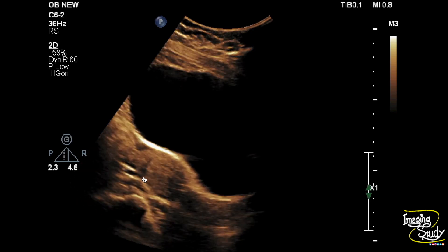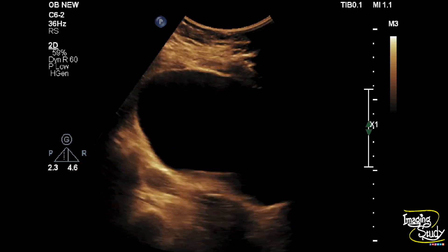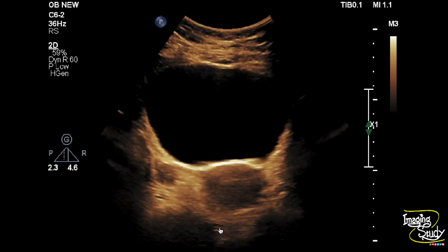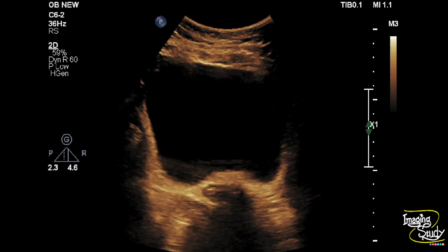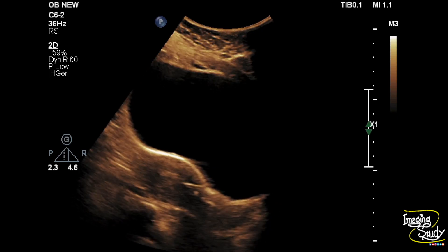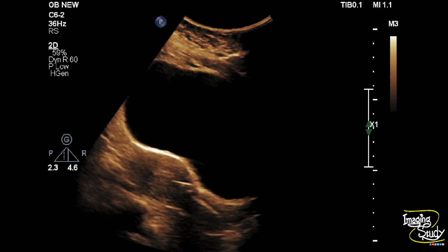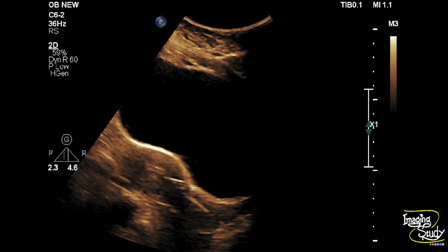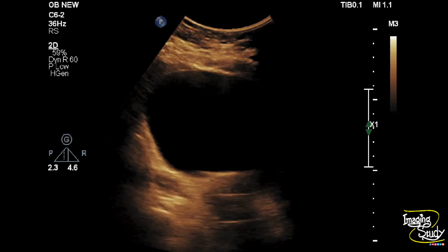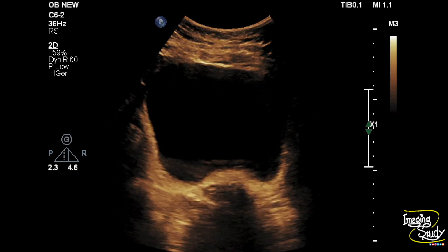The device should be at the upper part of the endometrial cavity, but here we can see this structure in the cervical cavity, indicating a displaced intrauterine contraceptive device. This patient was our hospital staff and she gave us the history that this displaced condition was diagnosed about five months ago, and she was afraid to remove it as it is embedded into the myometrium.